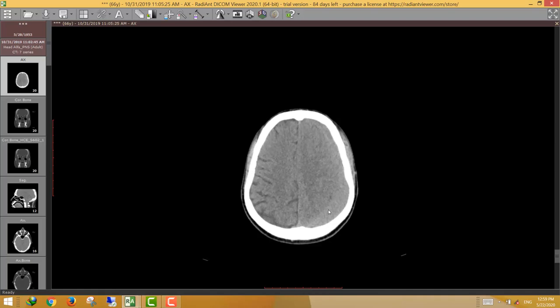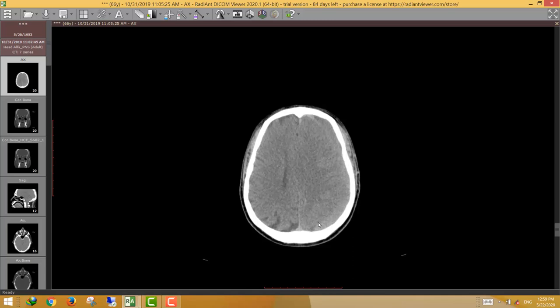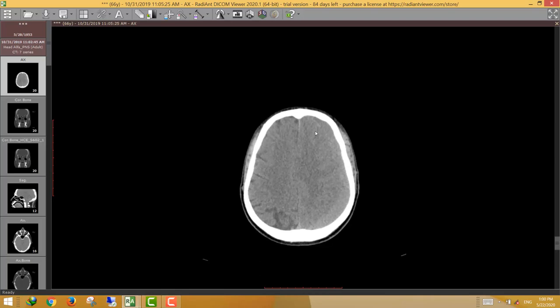The typical finding of subdural hematoma or collections is the concave inner border and the long or extensive involvement of most of the cerebral hemispheres, unlike epidural hematoma. There is also an interesting finding that can be a clue for such lesions: the absence or effacement of the cerebral sulci on the same side as the subdural hematoma. We can see there are multiple sulci here, but here there is absence and effacement of these sulci.